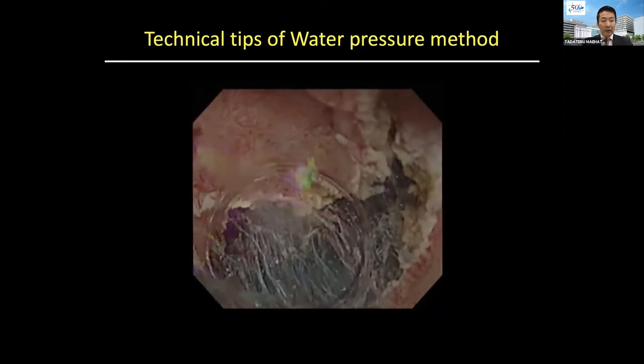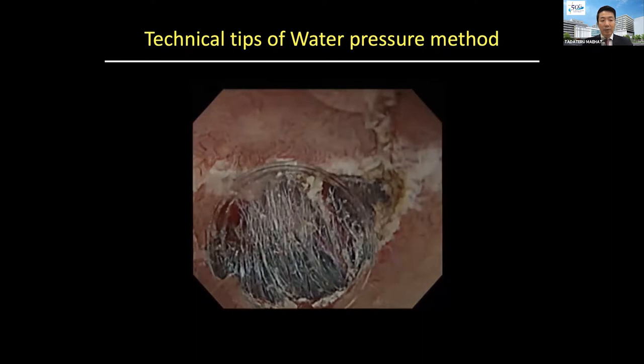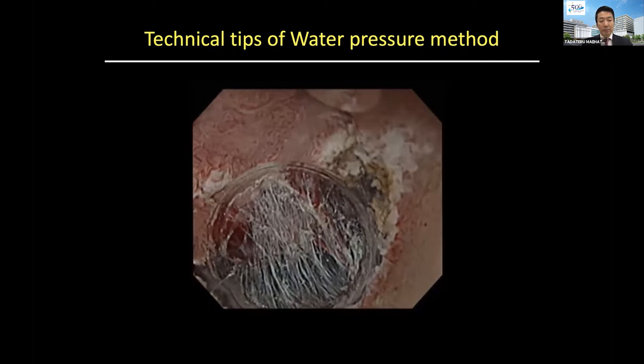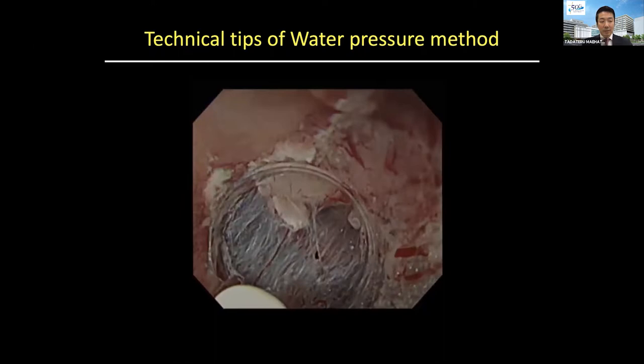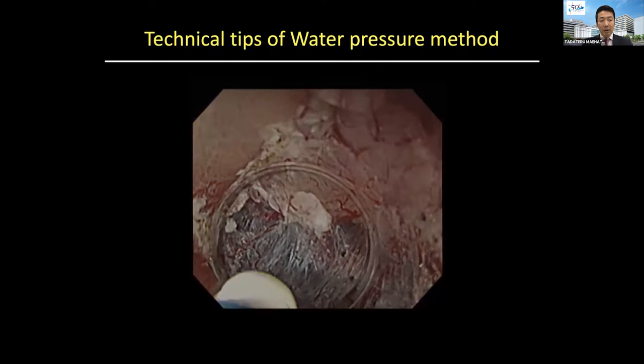Finally, we can go into the submucosal layer and create the mucosal flap. This also improves visibility within the submucosal layer, including blood vessels and the lateral edge. This method improves visualization of the lateral edge of the dissection layer, which is normally difficult to visualize in the dissection plane.